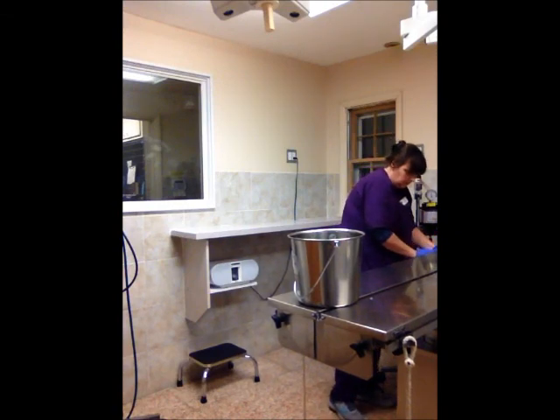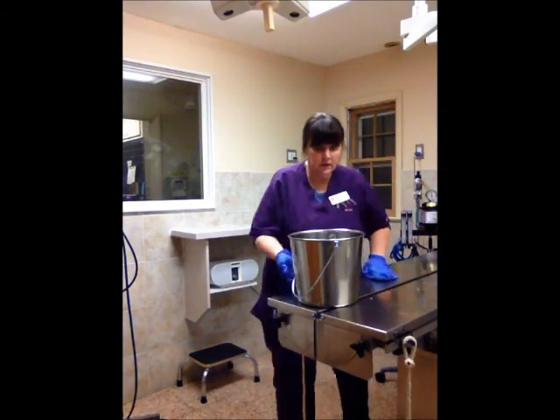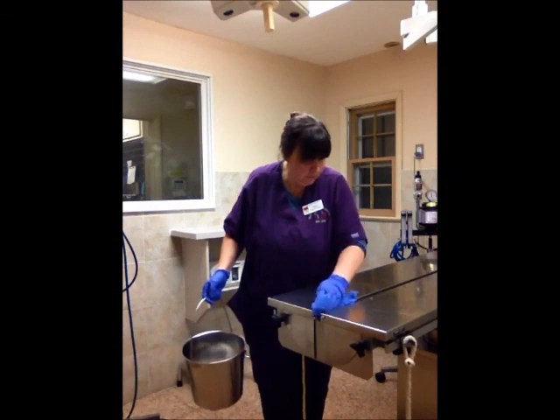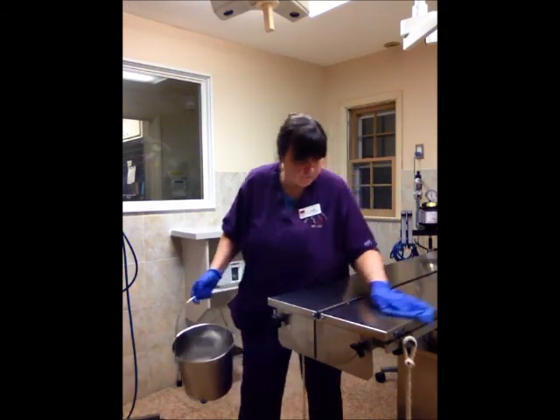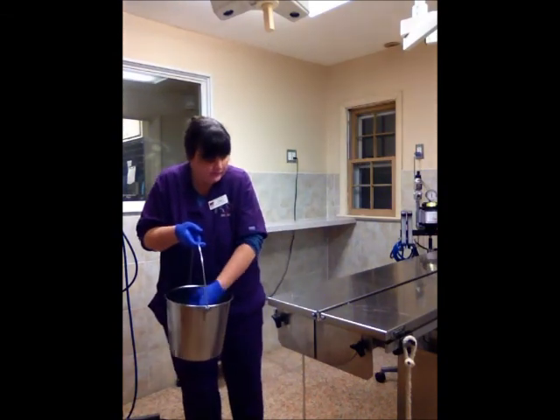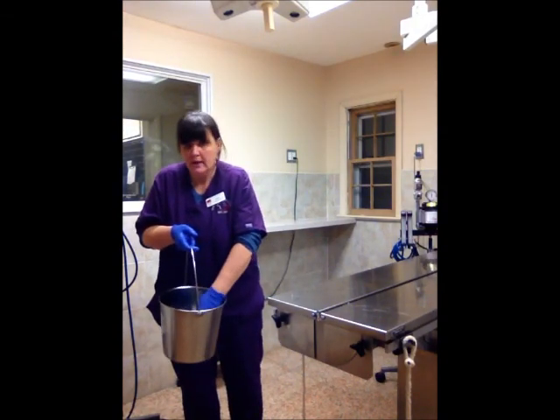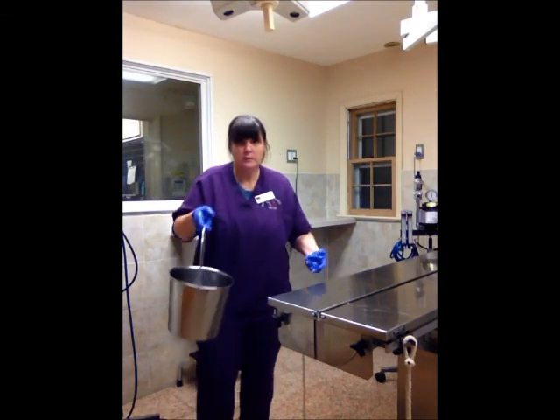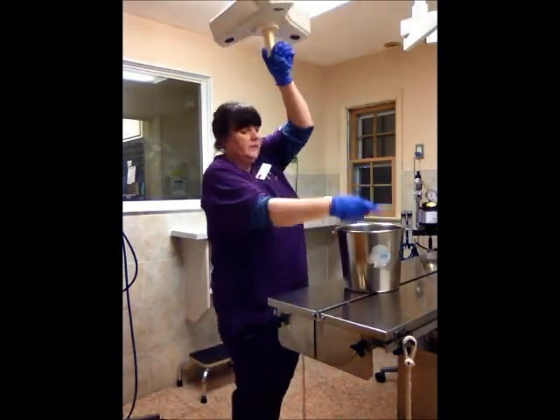So anything and everything gets wiped down from head to toe every day at the end of the OR. In the beginning of the OR, we will do a quick wipe down before we set up for surgery. But at the end of the day, everything gets wiped down. Head to toe, wheels, tops of tables, middles of tables, wheels. All of the lights will be cleaned.